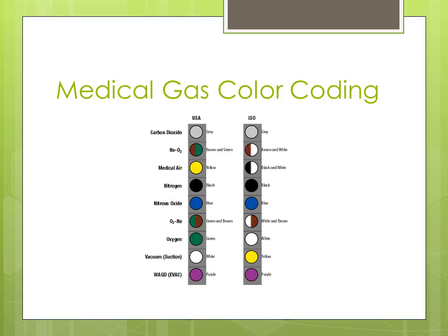And it's good to memorize these, get to know these, pretty much know these like the back of your hand, because again, you come into contact with these, whether they're pipes above the ceiling or cylinders in your bulk storage area. This is something to become expert at.